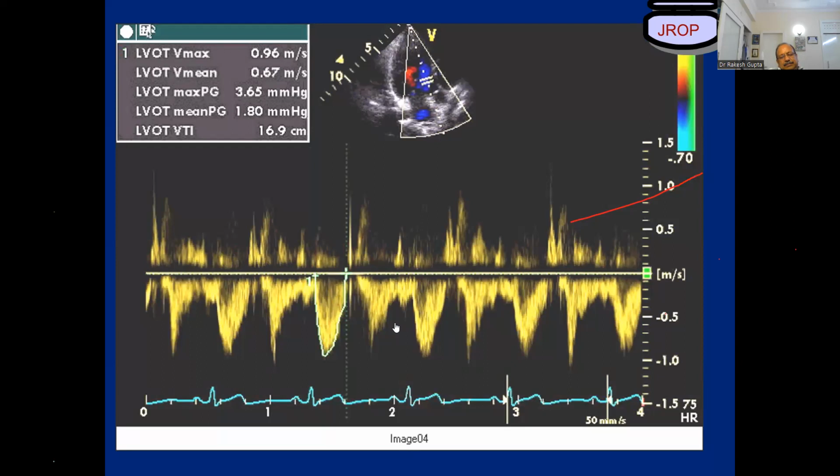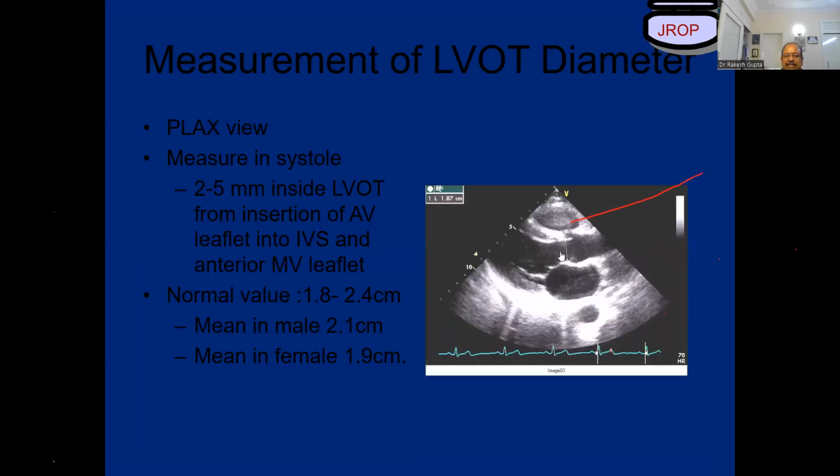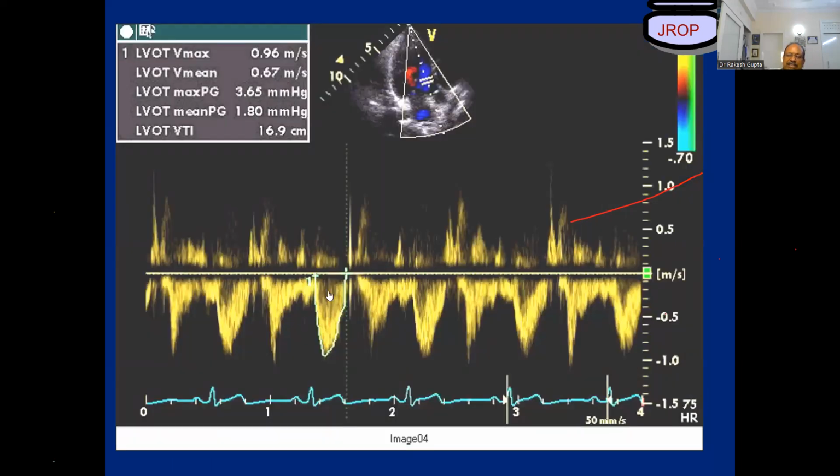Okay. So just one more thing, sir. I need to clear it up. When we increase the contrast, the gains are high. No, I don't say that. When we increase the gains of a 2D, this kind of picture will appear. Similarly, when we're doing a Doppler and increase the gains, this type of picture will appear. And moreover, we have some low flow filters, low velocity filters also. I'll show you those kind of things when I show live, because I can't describe in words.